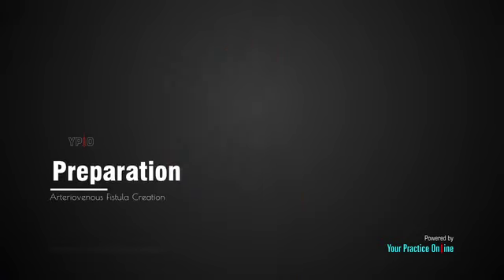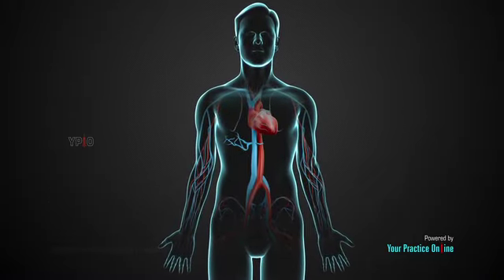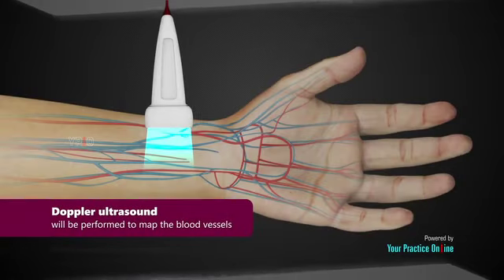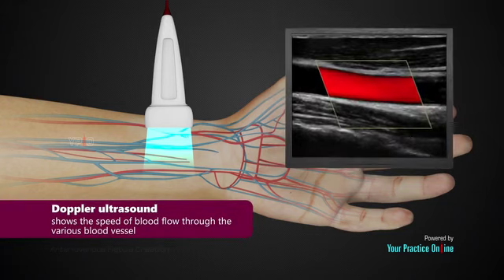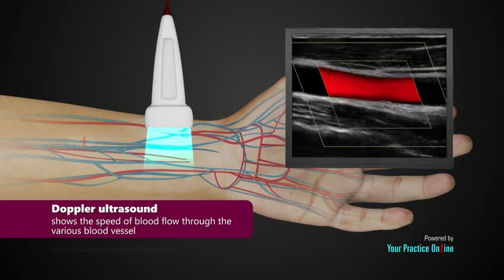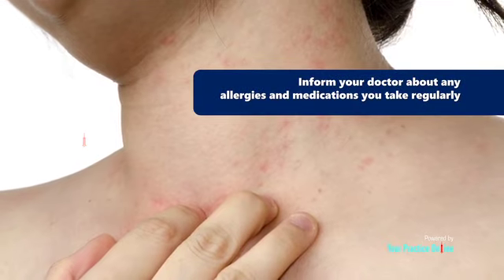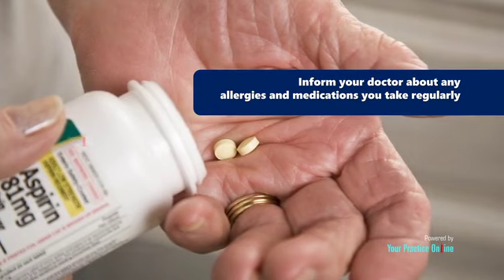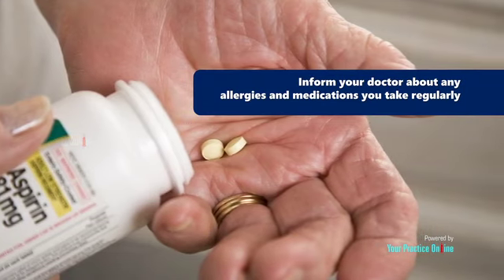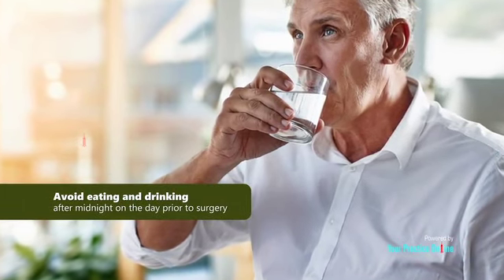Preparing for an arteriovenous fistula creation. In preparation for an AV fistula creation, a Doppler ultrasound will be performed to map the blood vessels. The ultrasound shows the speed of blood flow through the various blood vessels in the area, enabling your surgeon to choose the most appropriate blood vessel for the fistula. You will need to inform your doctor about any allergies and medications you take regularly, as certain medications such as blood thinners may have to be stopped temporarily about a week before the procedure. You may be asked to avoid eating and drinking after midnight on the day prior to surgery.